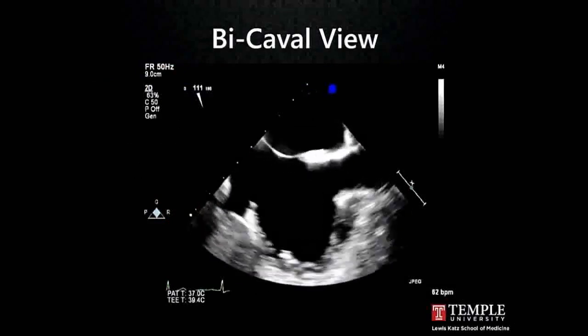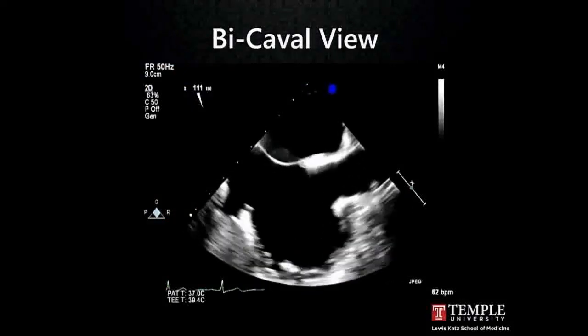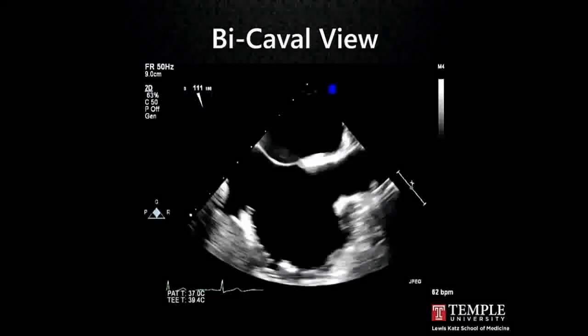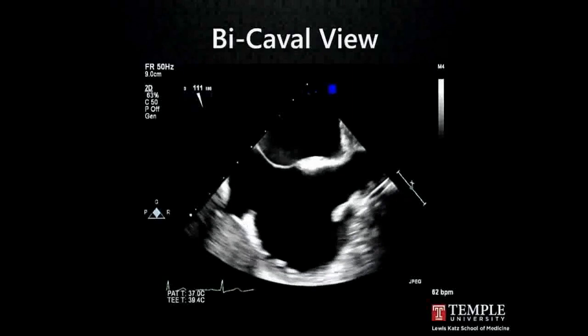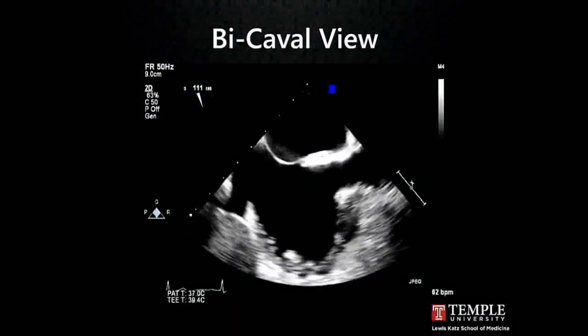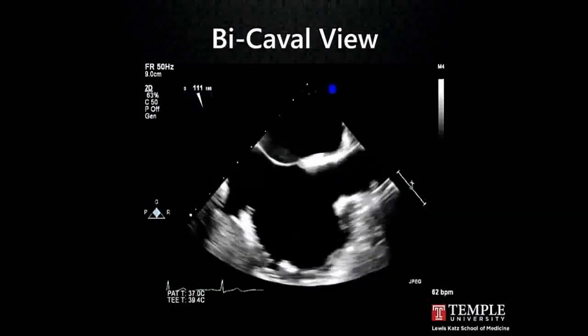Bicaval view is a common view. Here you can see the SVC entering the right atrium from the right. You can see the crista terminalis is pretty prominent there, that fibromuscular ridge, just as the SVC empties into the RA. You can see the interatrial septum, and then at the 9 o'clock position, you can see the IVC as it enters from the liver. So that's the suprahepatic IVC.